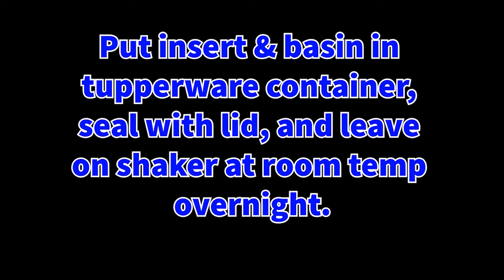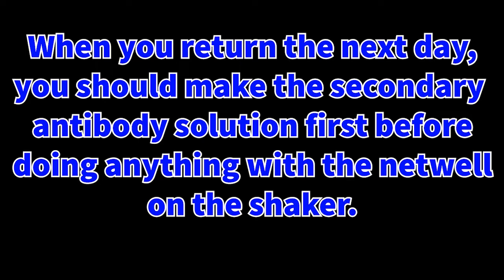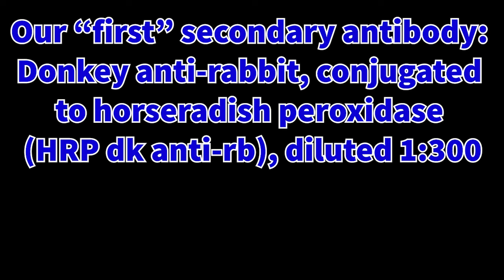Otherwise solutions will go down, sections will dry out, and it will cause a mess and loss of sections. When you return the next day, you should make the secondary antibody solution first before doing anything with the netwell that's currently on the shaker. This is due to the fact that making the secondary antibody solution can take some time, as well as the fact that it should be made fresh right before use. I will first make the donkey anti-rabbit HRP conjugated secondary antibody.